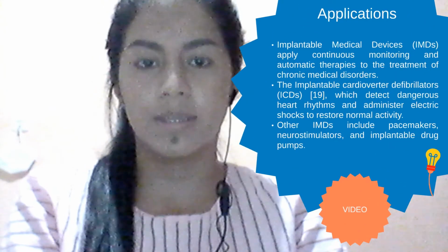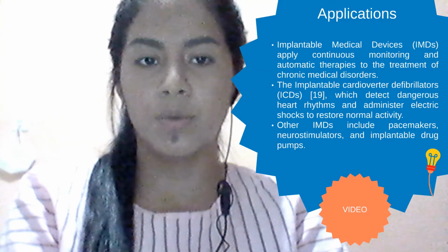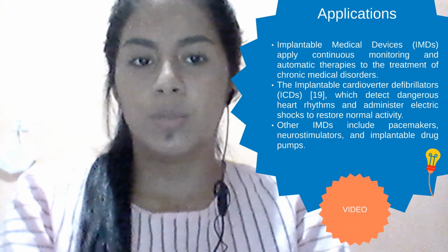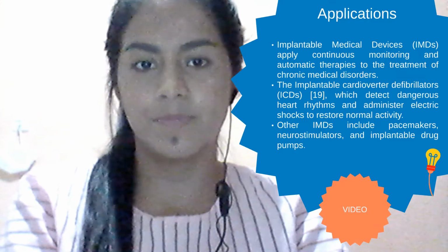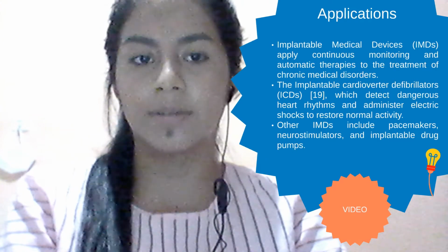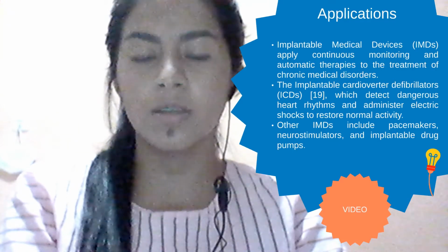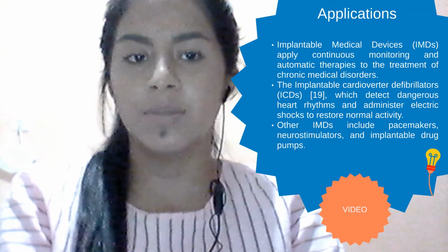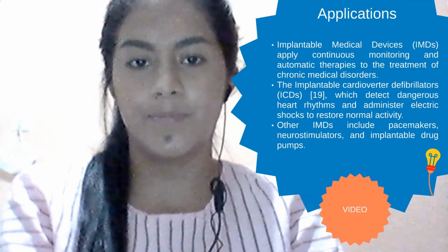Applications: implantable medical devices provide continuous monitoring and automatic therapies for the treatment of chronic medical disorders. Implantable cardioverter defibrillators (ICDs) detect dangerous heart rhythms and administer electrical shocks to restore normal activity.